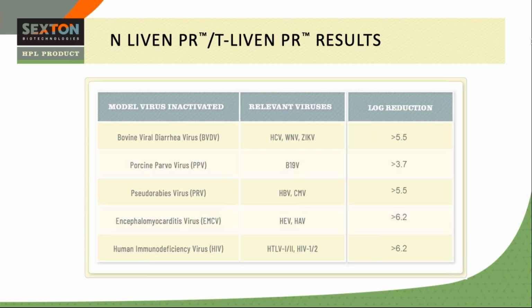So we were very happy with the results of the irradiation process, and by employing this development and validation approach, we were able to produce a product which had the same growth performance capability as the non-irradiated product. However, we did notice that the irradiation process inferred a positive effect when the product is used for expansion of CAR T cells, and there's more to come on that in a few slides.